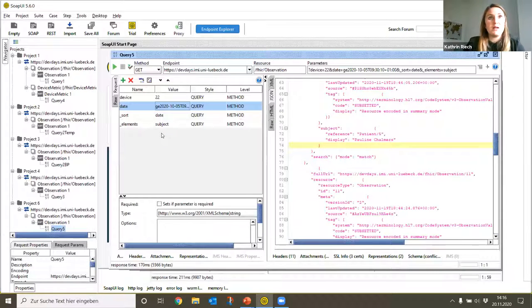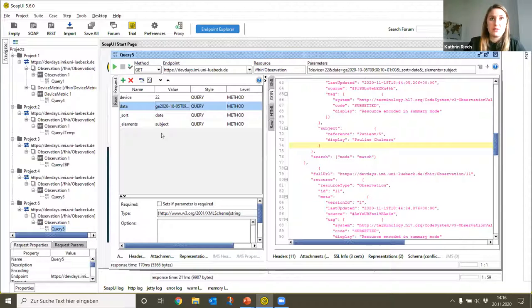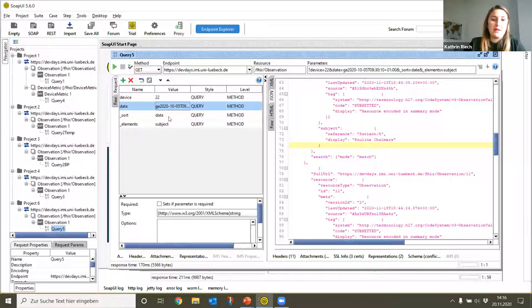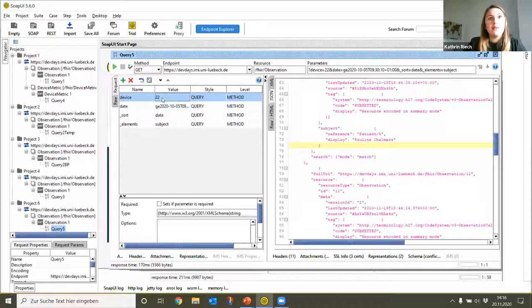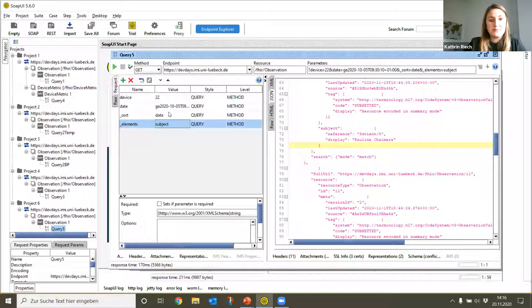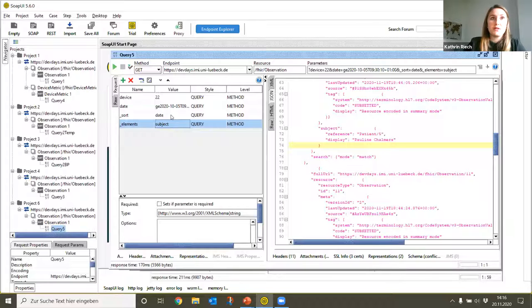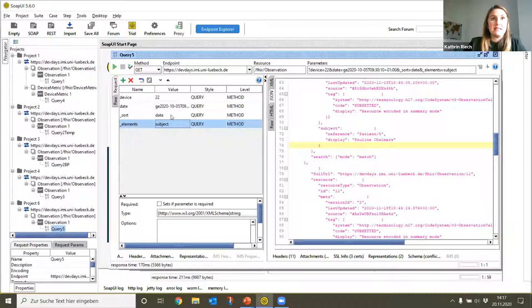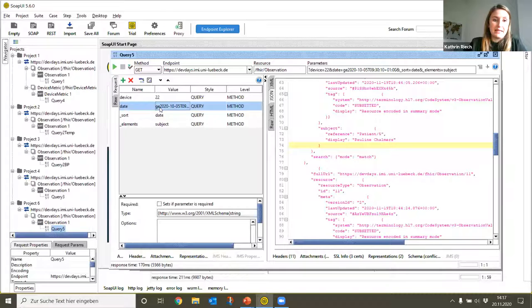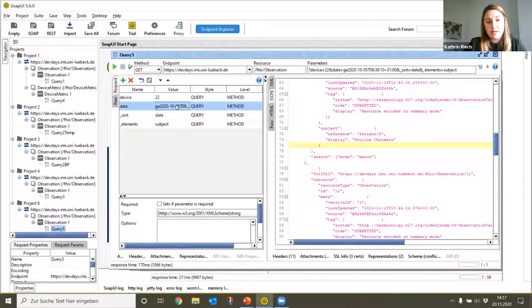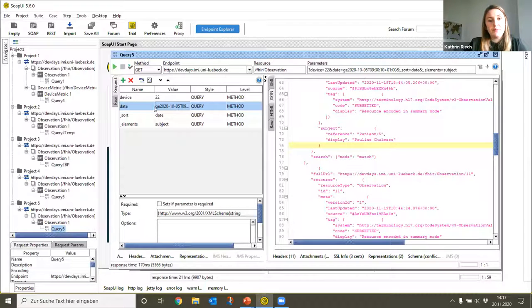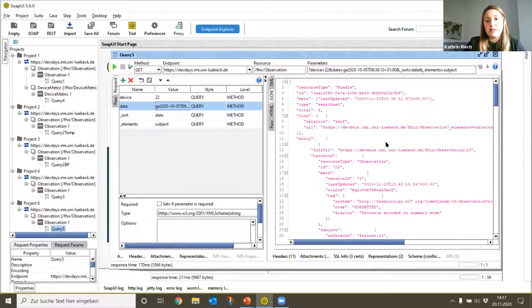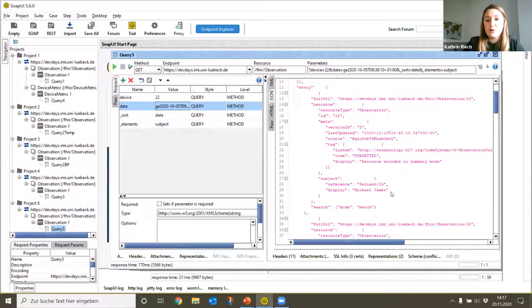To find out for which patients measurements with the thermometer have been performed lately, we want to find the Observation resources performed with the device ID resource 22. The most interesting output here is the patient, so the attribute subject. Since the thermometer is frequently used, it is not worthwhile to display all outputs. We can indicate that the date should be greater or equal to a certain value by using this 'ge' before the date. Of course you can use as well less, less or equal, or other parameters.